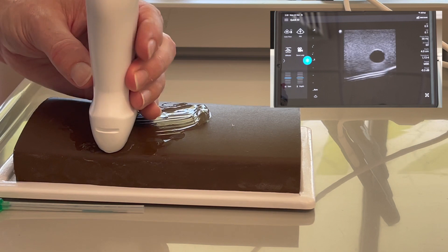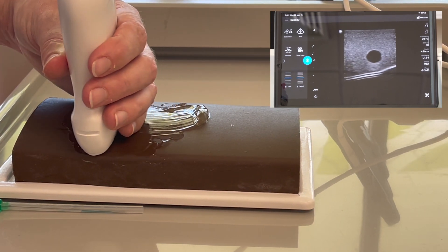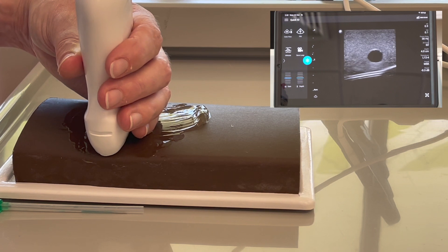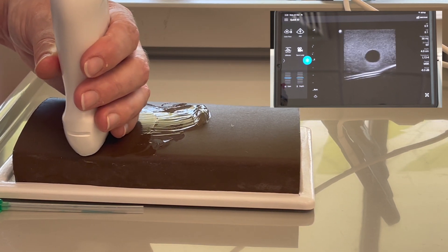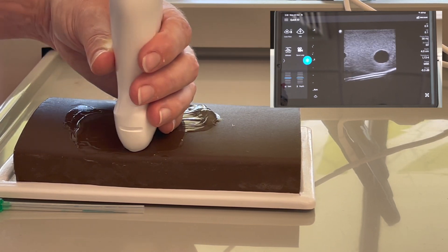When using the ultrasound, you want to make sure you're nice and stable. You've got all points of contact — that would be a hand, an elbow, even your bottom and a chair — so that you're nice and stable and can just do nice, gentle, smooth movements.